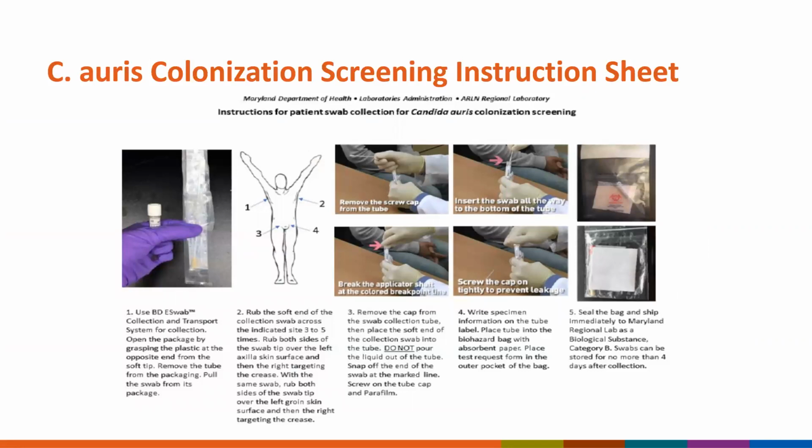You'll see the cheat sheet. So we give you instructions on how to collect the specimen, where you should be swabbing, and how to package it, and make sure that you know where you place the lab requisition. Next slide, please.